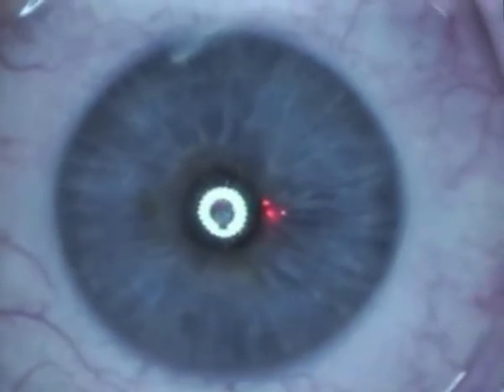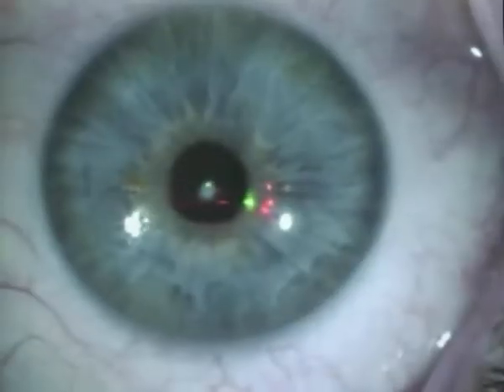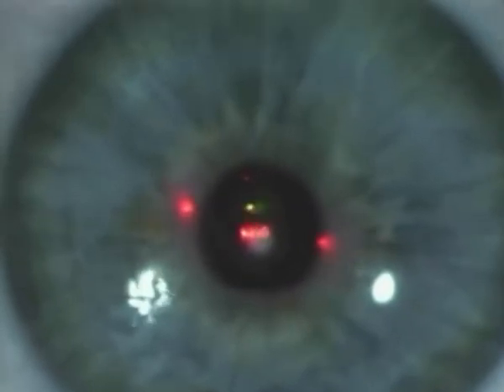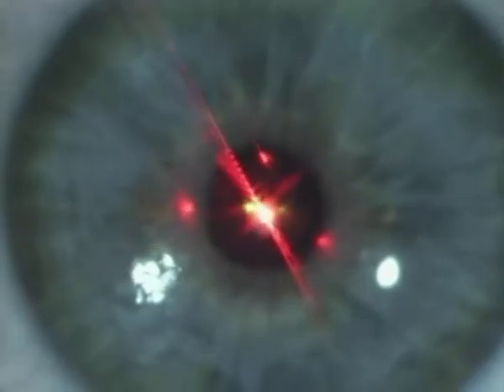Initially, what we have to do is create a specular surface by wetting the corneal surface. This gives us the ability to have a good corneal reflex — the first Purkinje reflex of the coaxially fixating eye — in order to set our eye tracker on the vertex, on the visual axis.